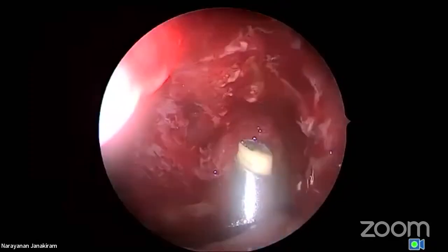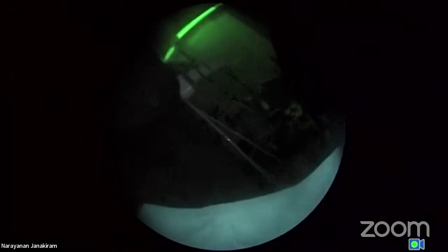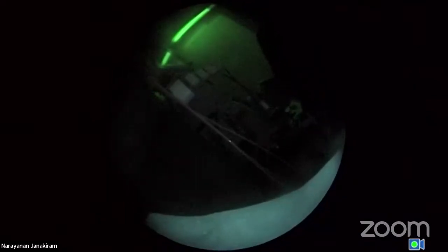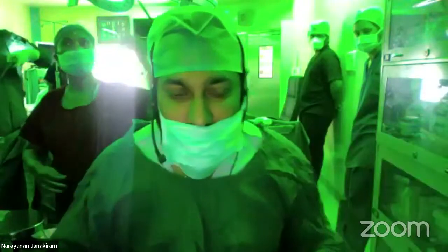Okay, that's it. Finished. So I'm not going to coagulate at all. So that's the advantage, I tell you, that you don't want to unnecessarily coagulate anything and make it like a pitch dry feel. That's it. Finished. Thank you. So I hope you learned some new technique of both adenoidectomy and tonsillectomy. Of course, the next case is far more interesting.